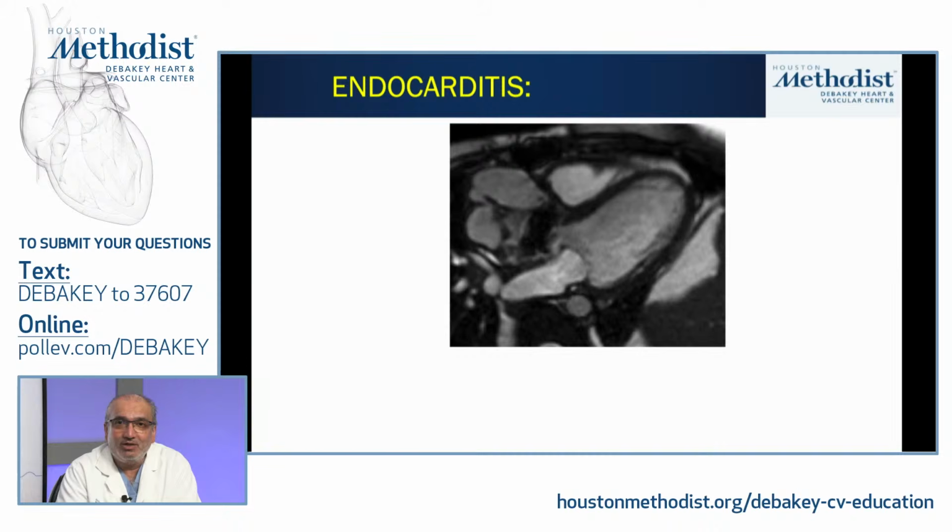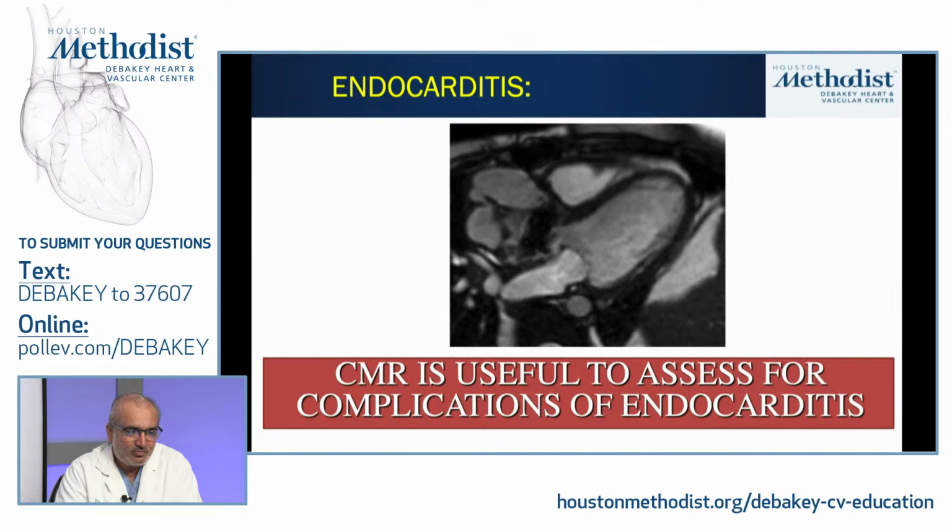However, if you have a patient who has known endocarditis and you're looking for the complications of the endocarditis, be it regurgitation or be it communications, abscesses and dehiscences, that's where I think MRI could be useful.